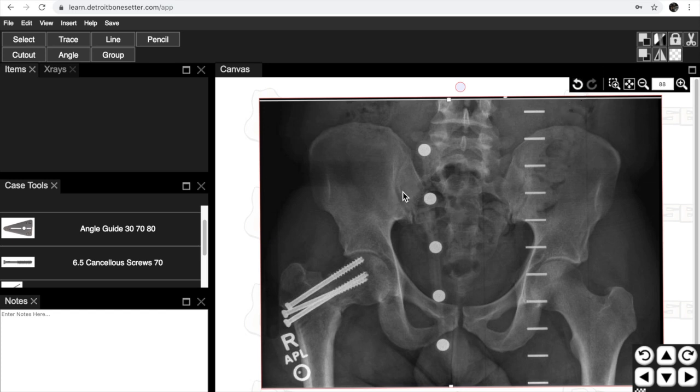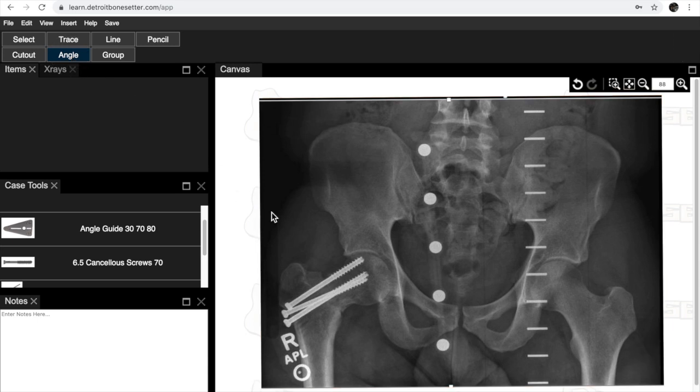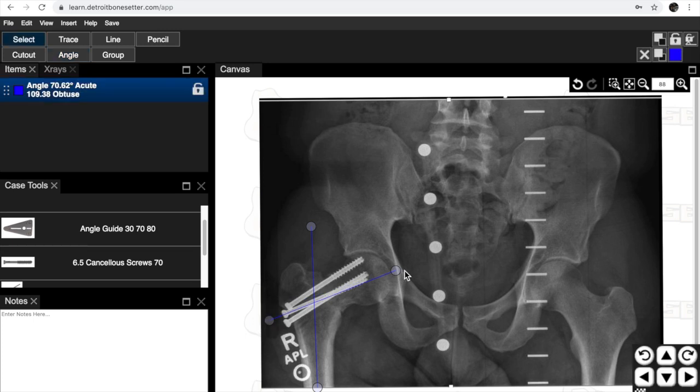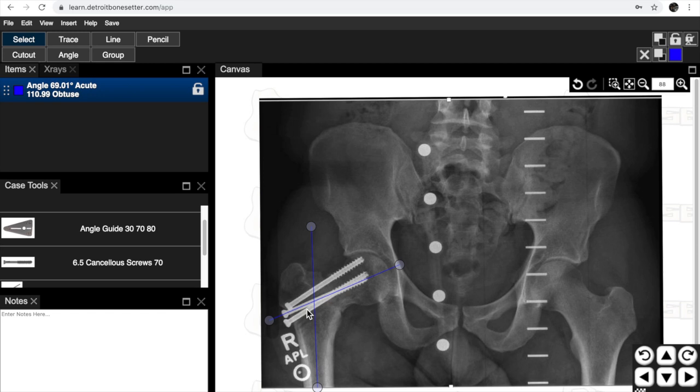A couple of things that you're going to be doing in this lab are making an angle. So you're going to need to measure the neck shaft angle. If you come up here and push angle, you can draw a line by making two clicks just like a Cobb angle. When you see these balls, you can move them up and down and you can see what the neck shaft angle is on the broken side.